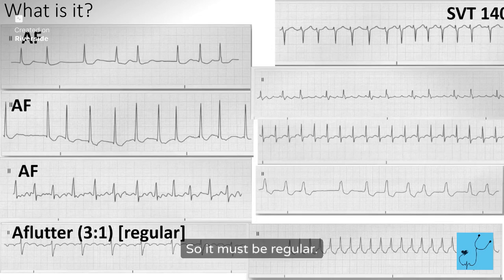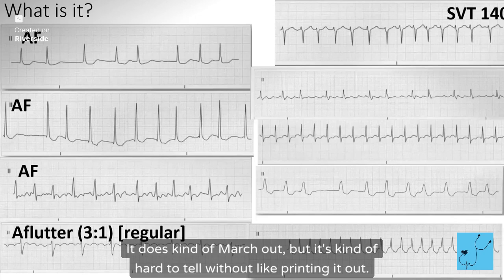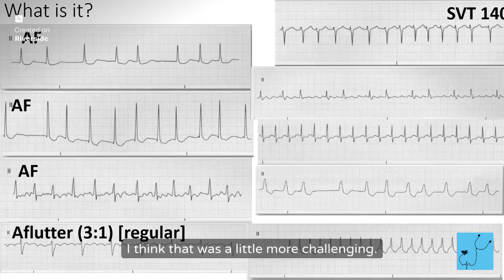So it must be regular, but it looks deceiving. It does kind of march out, but it's kind of hard to tell without printing it out. I think that one's a little more challenging.